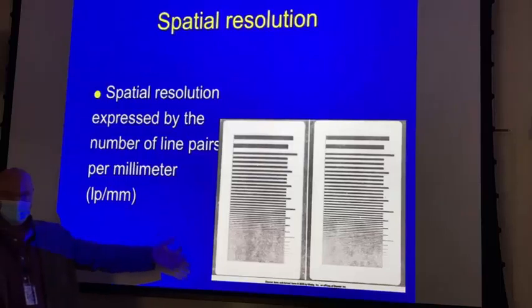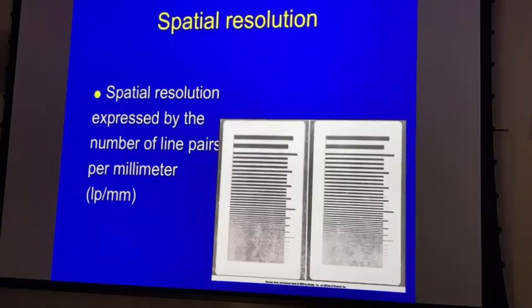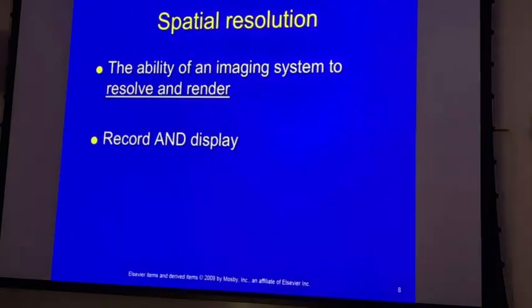You could test the resolving power of your image receptor systems with this as well, but they build that into the system now. So your resolution test tools for the system, and especially for display, are built into the system. So it's record and display spatial resolution.